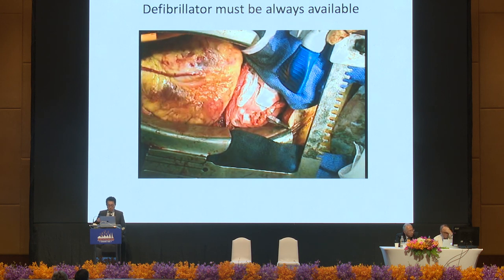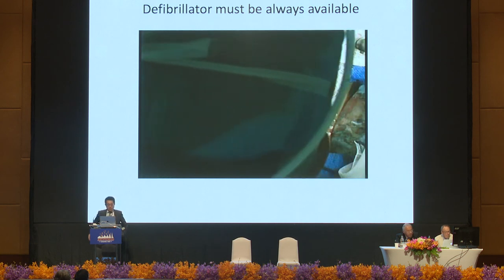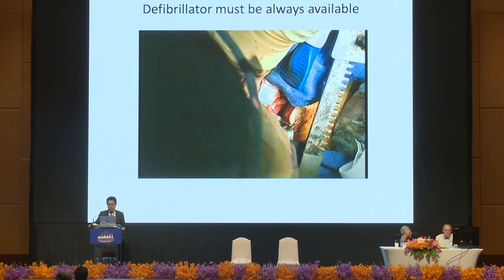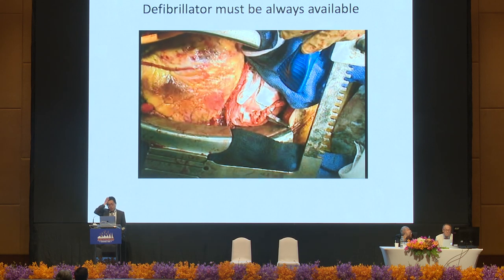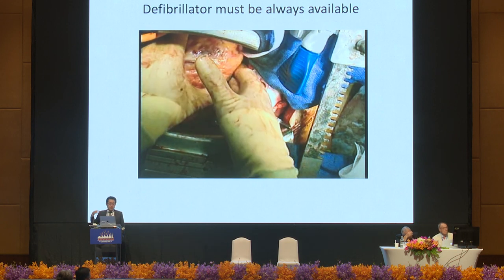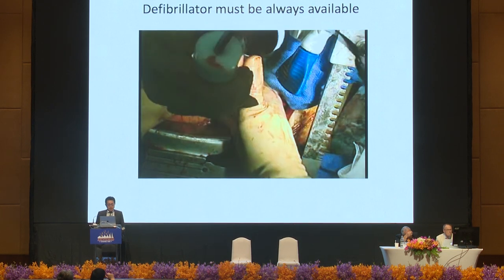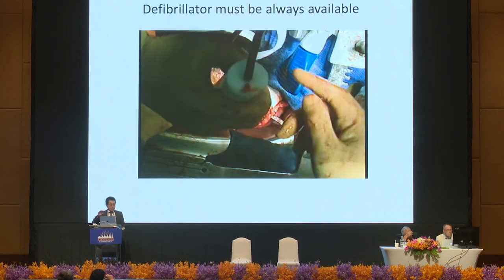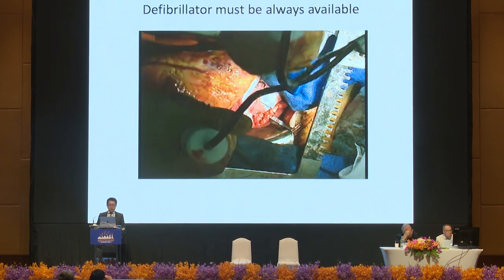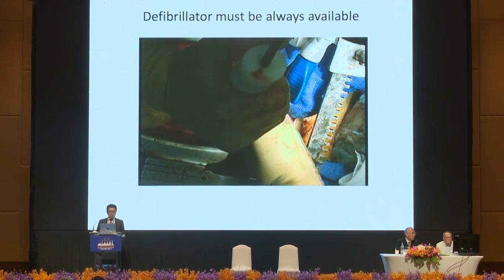And this is a video of the first case after LIMA-LAD anastomosis. The heart fibrillated suddenly. Well, I tried to manipulate the heart, and my assistant was preparing the DC shocker. But he's a little bit upset, so our first trial is not going very well. So relax. One more time.